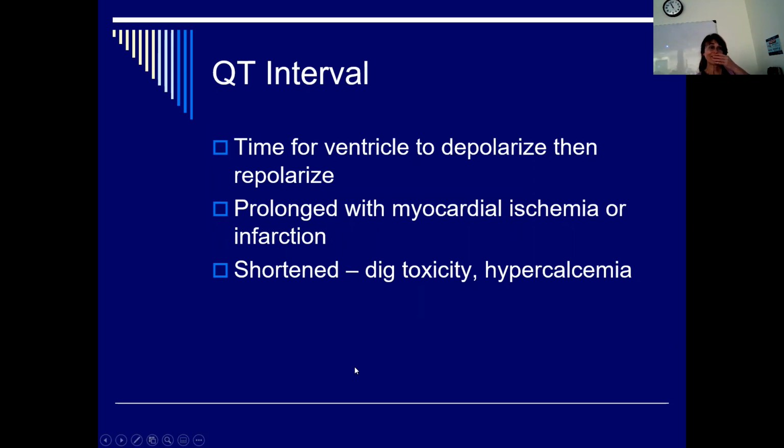The QT interval, if you measure from the beginning of the QRS to the end of the T, normally that should happen in, I don't remember the amount of time. Almost QT interval. Obviously, I don't ask this on the test. No, I don't have it written down either. Oh, it says it on the slide.